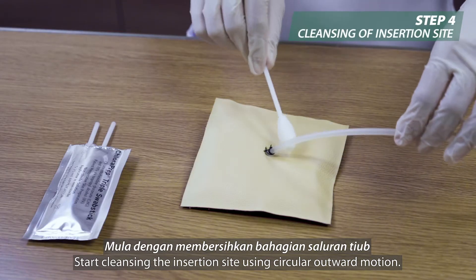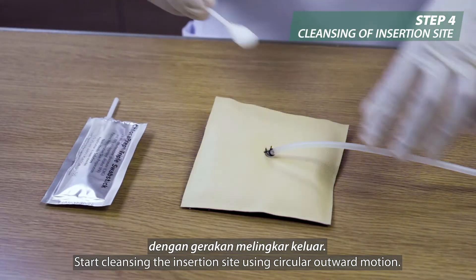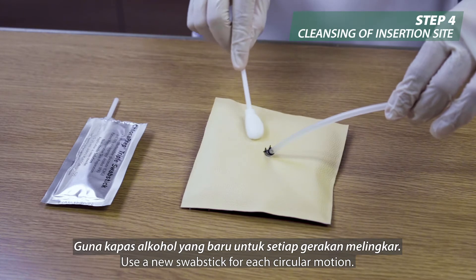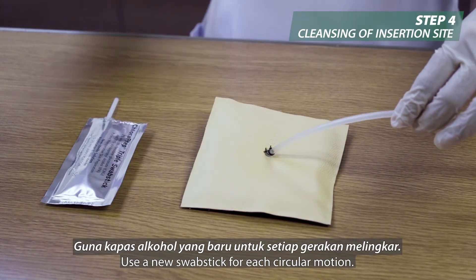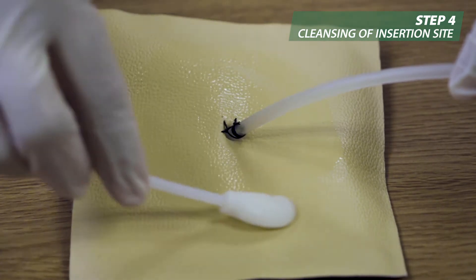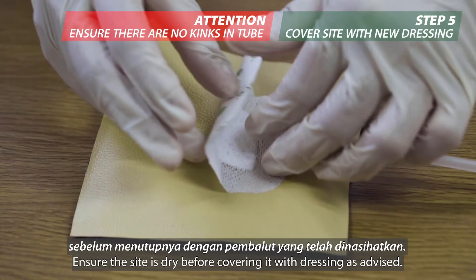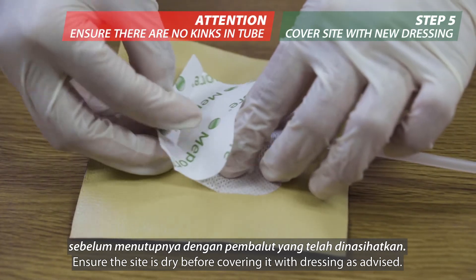Start cleansing the insertion site using a circular outward motion. Use a new swab stick for each circular motion. Ensure the site is dry before covering it with dressing as advised.